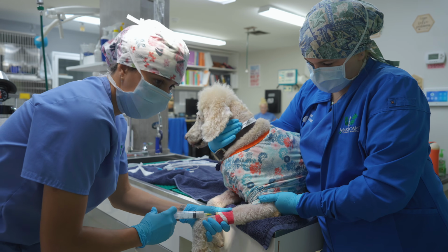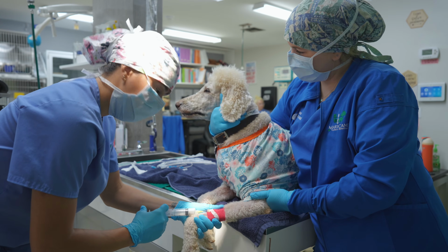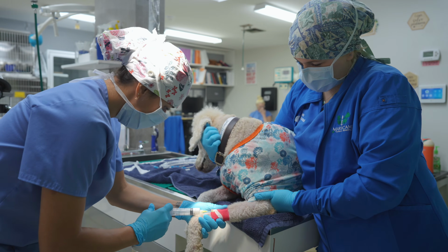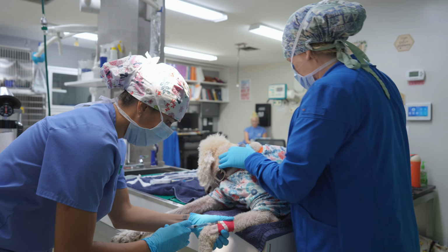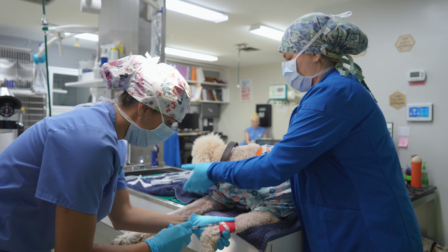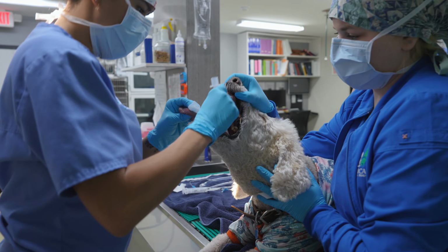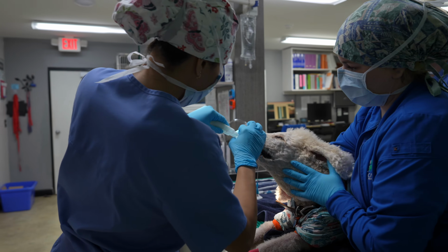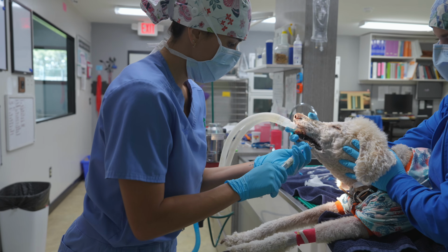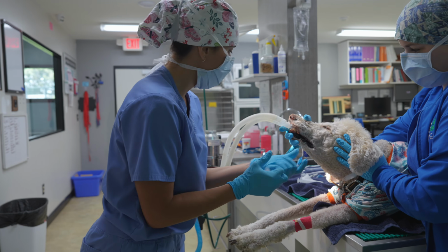It's to effect. We go slowly. Feeling sleepy? Starting to feel it. Some flush to help the propofol that is on the hub and on the catheter to move in. Good job. Good. This machine will help us control how deep we are under general anesthesia or how light we are.